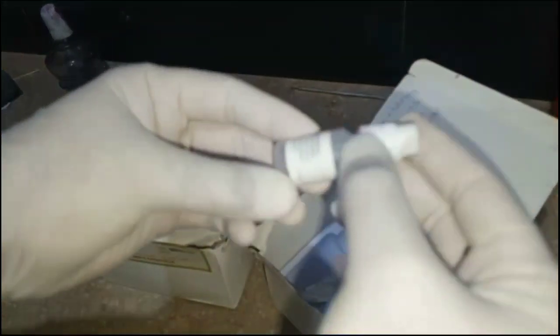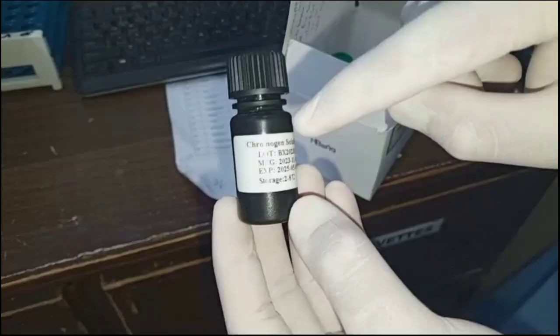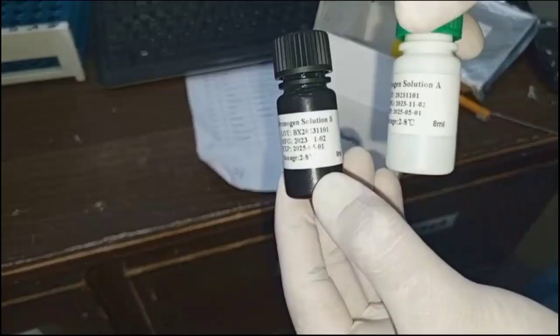Moreover, this kit also contains the stop solution. So this is the stop solution. Now this kit also contains the color A solution. The white one is color A, and the black one is color B.